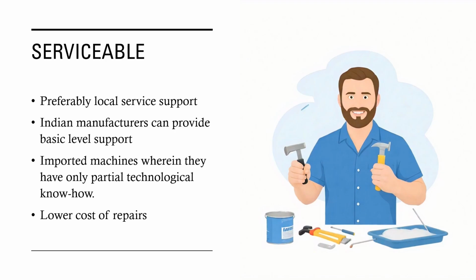With imported machines, the engineers are trained at the facility where the machine is being built, which is usually outside India, and they give you only partial technological know-how. So their modules can be changed, but the repairs are not at a basic level. As a result, the Indian companies will give you a lower cost of repairs, and this will matter once you have purchased a machine.